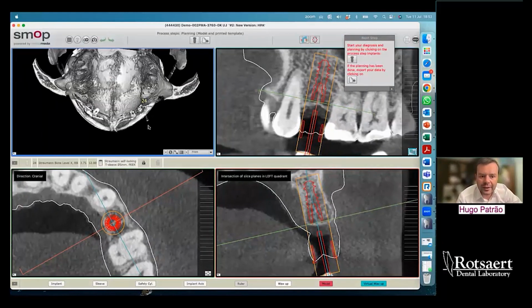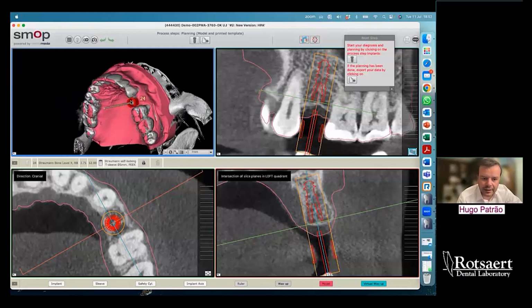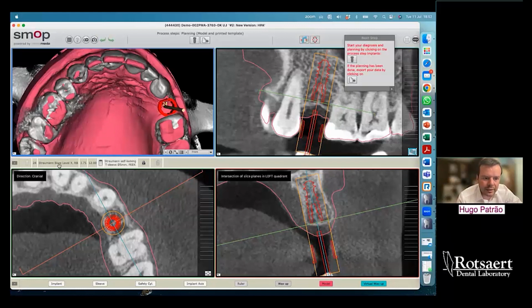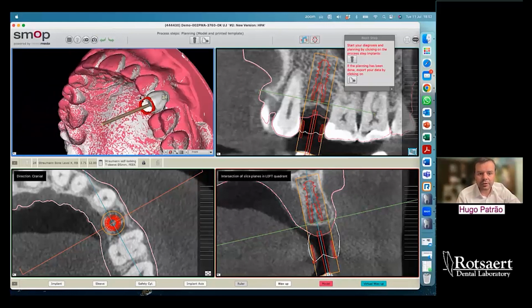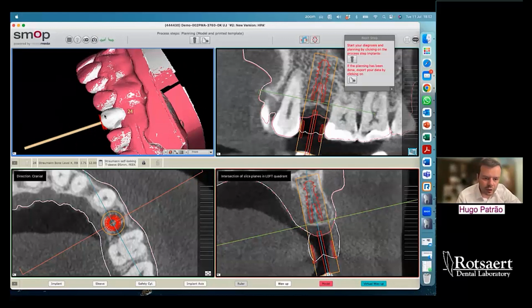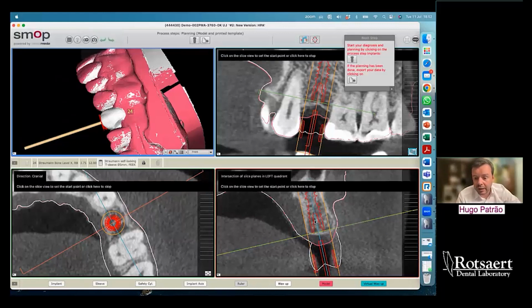And when you see the case over here, now you see that exactly what you planned, your model is there with a Straumann bone level X with a T-sleeve. And look what the lab did for you as well. They create a wax up. So now you'll be able to see and to measure the zenith of the case. So even if the lab creates a little bit of mistake, as I have it here, see the same case that we have before, you can go and adjust your case. Let's measure 3 millimeters up, like we discussed before, 3 millimeters to the sides. Perfect. Now everything is as it should be.